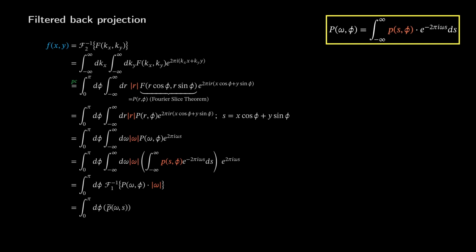Finally, we want to bring this in a form that computers can understand. As computers only understand discrete summation and not continuous integration, we sum over all projections. Capital M is here the total amount of projections, and small m goes from 0 to m-1. We have made it! Now we can write a few lines of Python code and make a tomographic reconstruction.